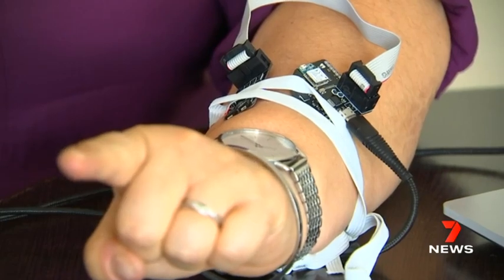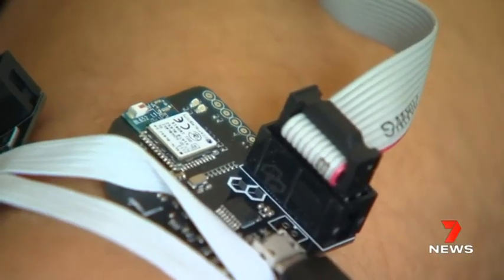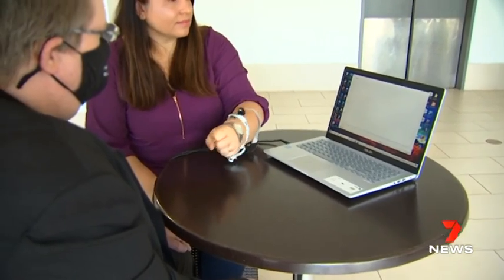The therapy is you play a game just using your mind. So if you focus in a certain way, the character that you're playing with, or the plane that you're flying, you can make it move around in the game just by thinking about it. And that is the therapy. So what we knew we had to do was create a therapy that was entertaining and fun, because people with difficulty concentrating don't want to do anything that's boring.